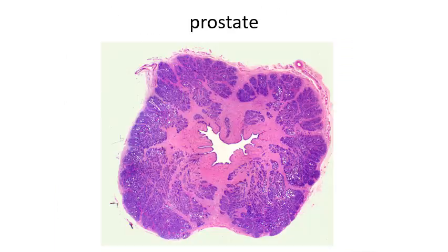Glandular structure: here we have exocrine and endocrine. The exocrine is formed of acini and duct. Here is the prostate. How could I know the prostate? Here is the prostatic urethra, which is lined by transitional epithelium. Here are the acini.